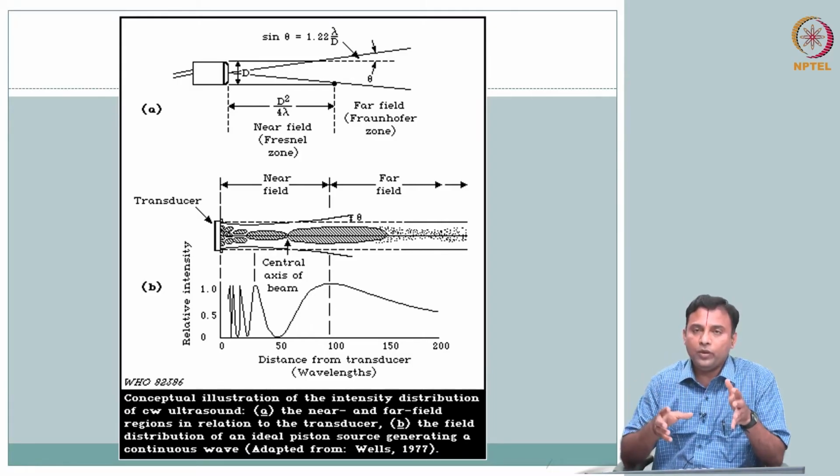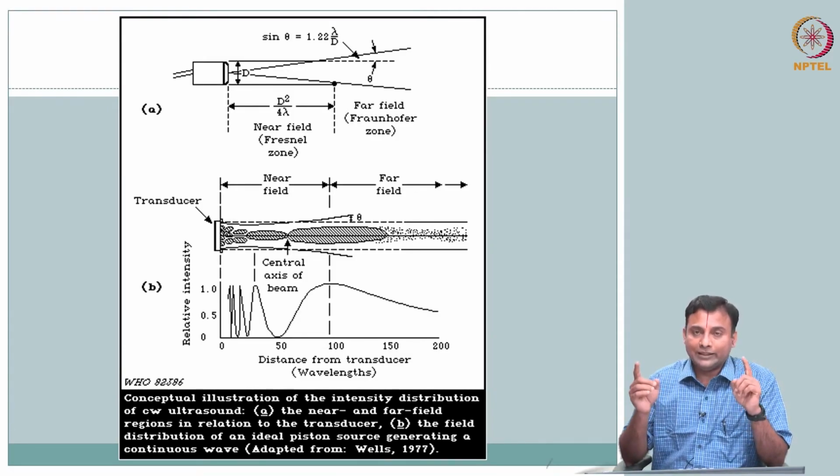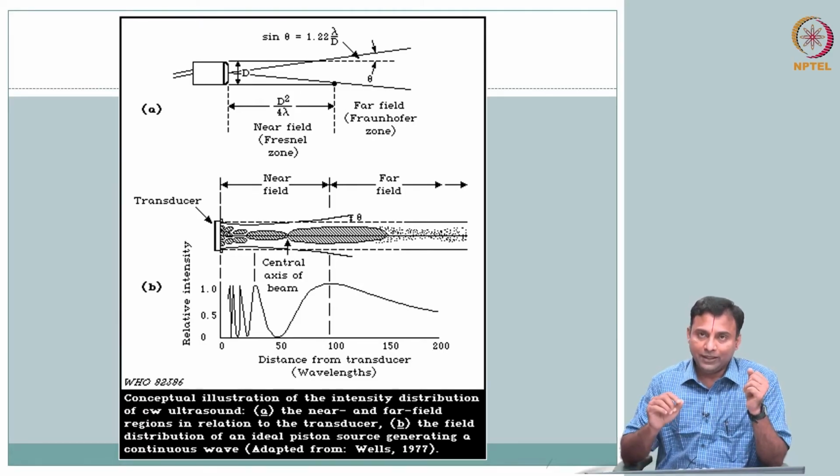Okay. And so, now we are at a stage where we understand that we can use a transducer and give it harmonic excitation, and that could give you a pressure wave. So, the challenge that we are now going to address is, what is the shape of this pulse, what is the shape of this waveform. I excite a transducer, and the frequency is dependent on the thickness, that is what we saw. The thickness of the crystal determines the resonant frequency, but then we also want to know why there are different sizes and shapes of transducer.